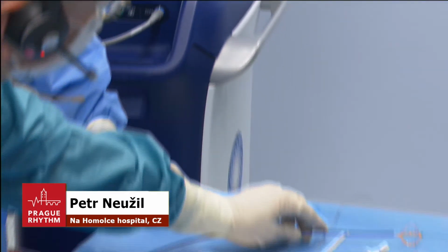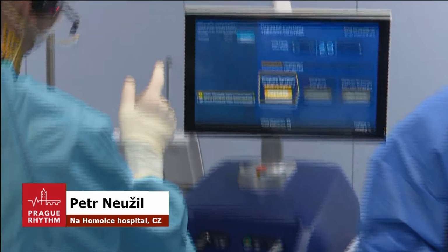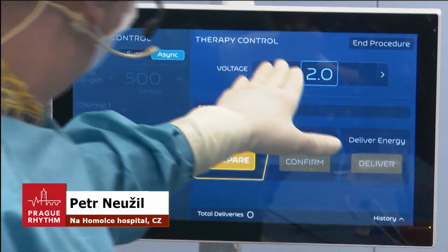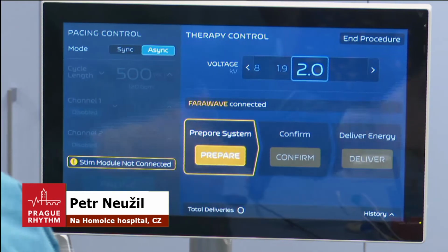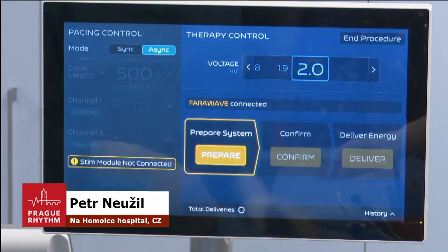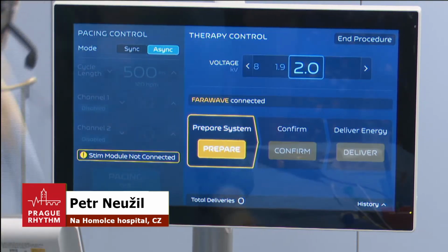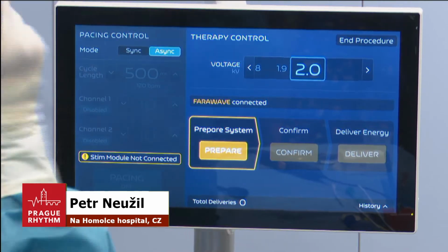You can show also the console. We are able to use 1.8, 1.9, and 2,000 volts. For all our procedures, we are using 2,000 volts because we have no reason to make a lesser one, because it's not about irreversible or reversible. The console is very easy to use. When we are in the position, we confirm the position, charge the generator, and then deliver.